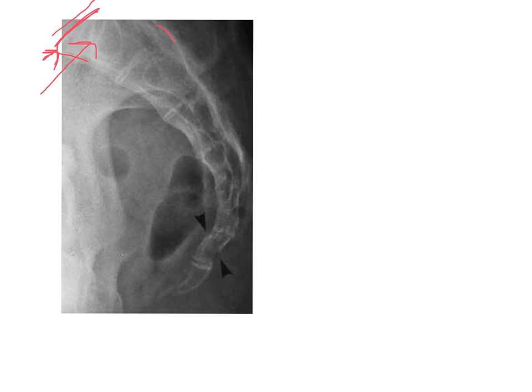Looking more towards the posterior of the sacrum, we are looking at the median sacral crest. And remember, the sacrum has a convex curvature to it. It's shovel-shaped, so it turns around this way. You're seeing some arrows down here. This is indicative of a fractured tailbone, which is one reason why we would do this projection.